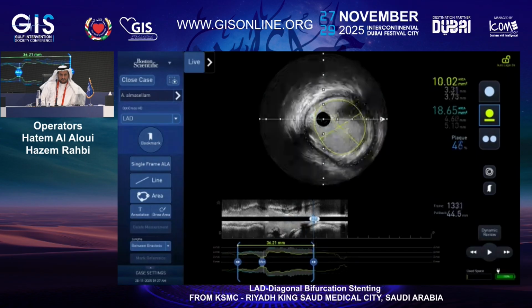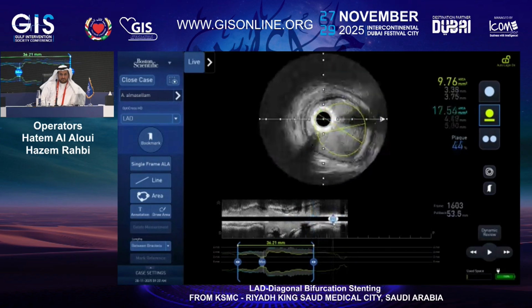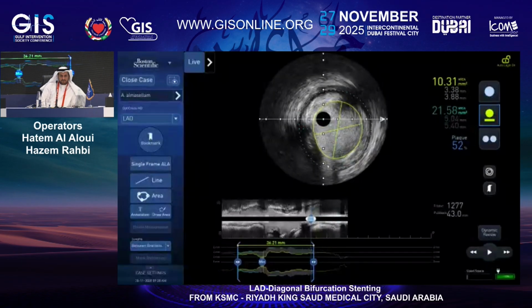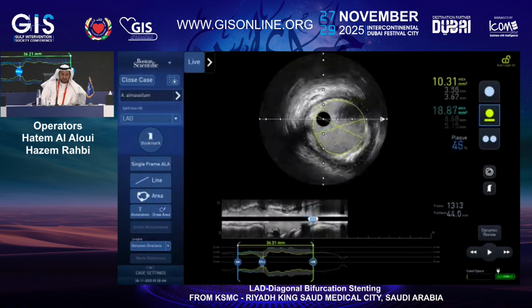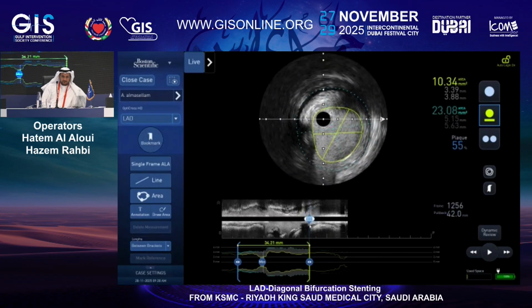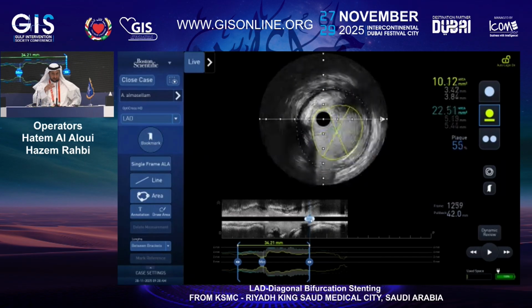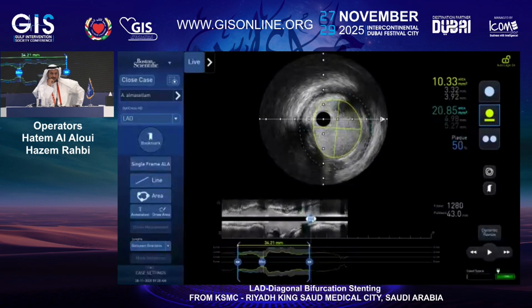And we thought, yeah, so I'm just trying to scroll. You know, it's a small circ. This is where the circ is. So we thought somewhere here, maybe we can land our stent proximally. Plaque burden, I think we tried to get an area better, about 40%. I think you have to get as close as you can to the ostium.